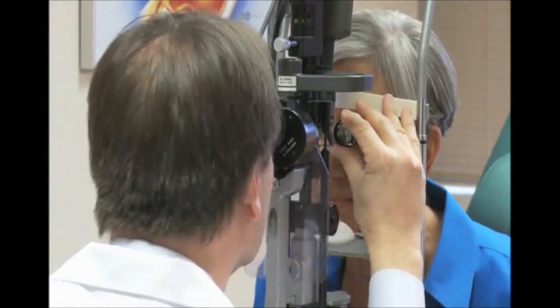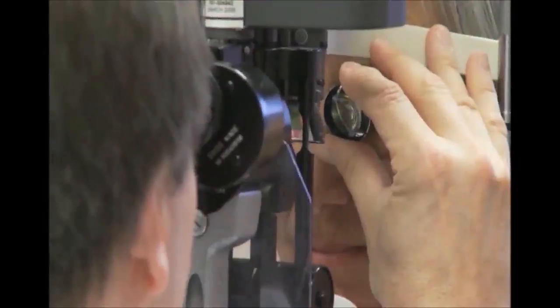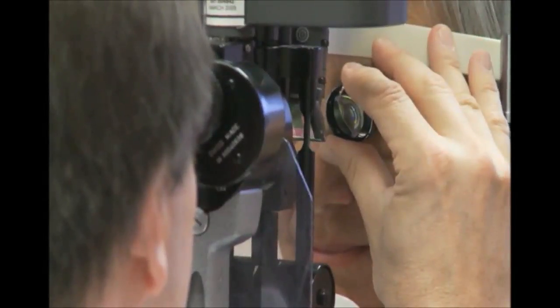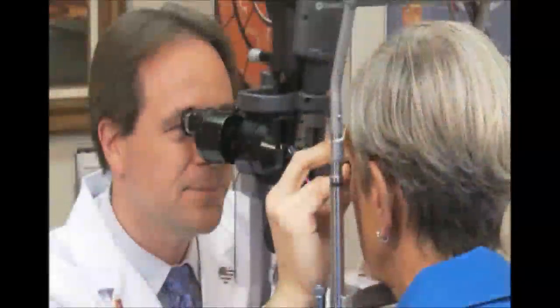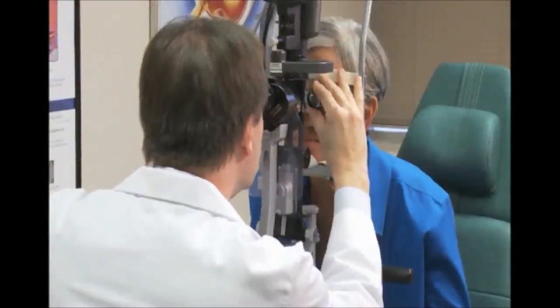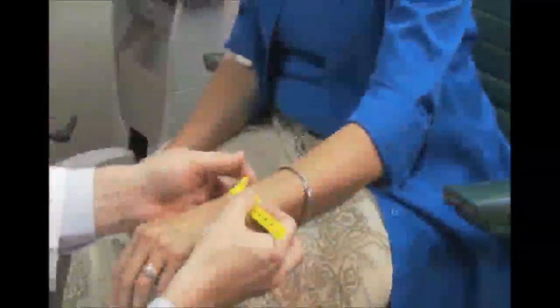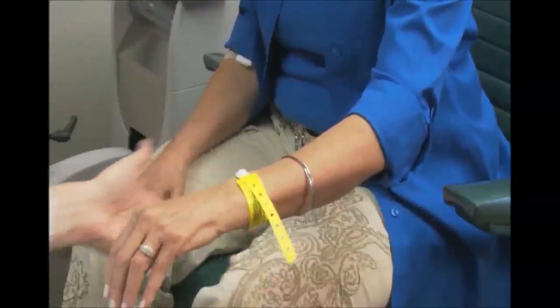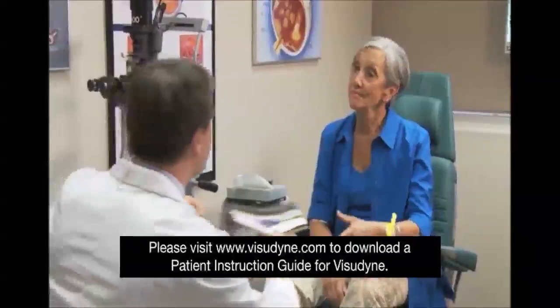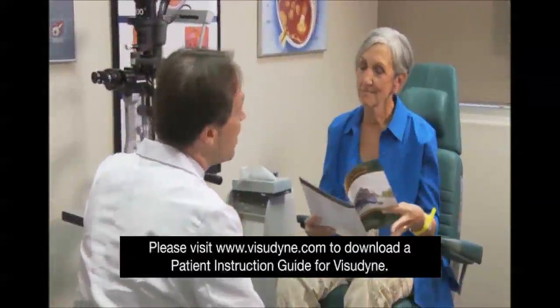Use a suitable ophthalmic magnification lens to cover the lesion, leaving a 500 micron border that is at least 200 microns from the temporal edge of the optic disc. After completing Visudyne photodynamic therapy, provide the patient with a light sensitivity warning bracelet and printed instructions regarding the safety precautions that should be observed for the next five days.